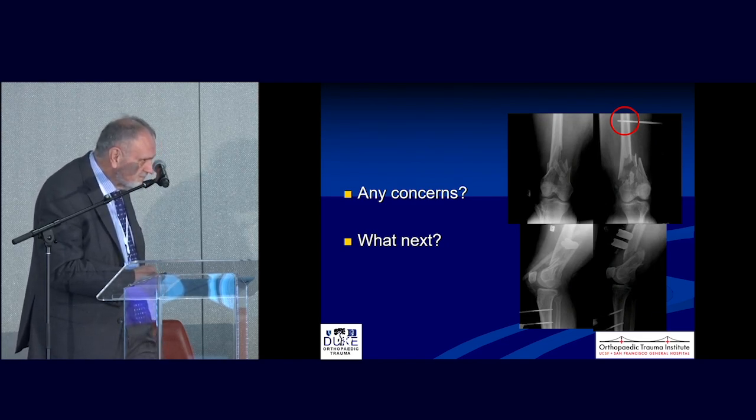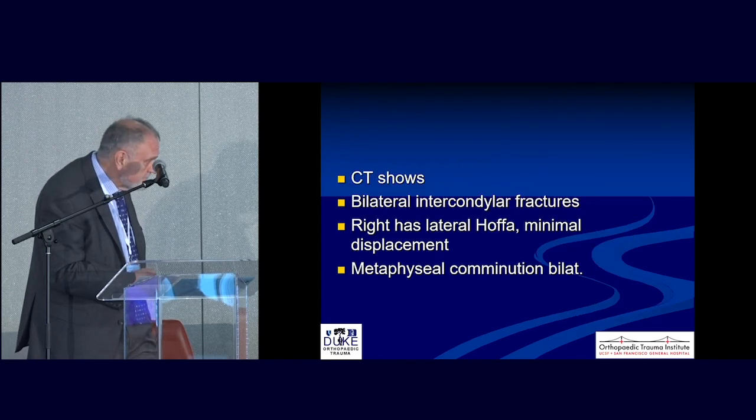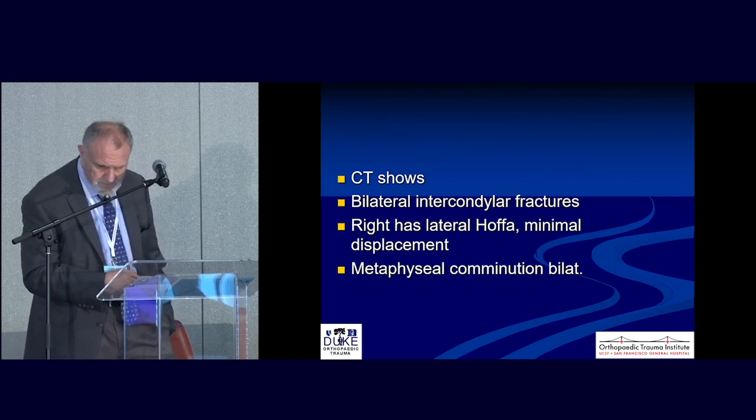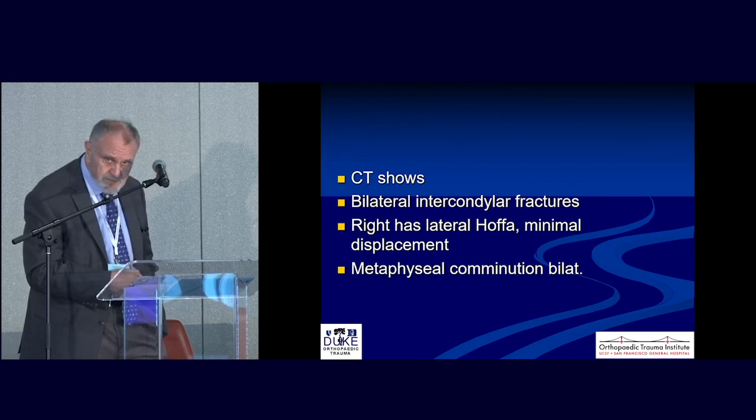Talking about the artery, I never use the self-drilling pins because the tip of the pin is the drill bit, and the pin has to go way through the posterior cortex. And if you get a CT, which you're going to do, you'll see how close that is to the artery sometimes on that distal pin. So we're okay anteromedial on the tibia and either straight or slightly anterolateral on the femur.